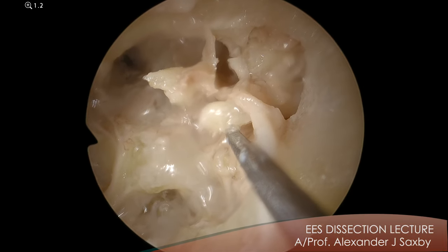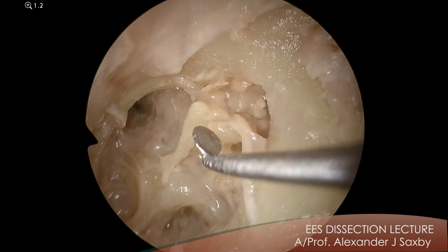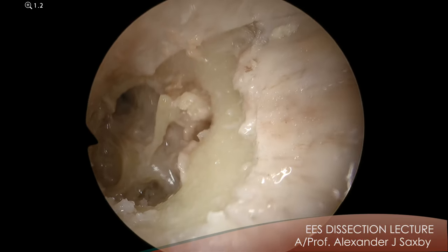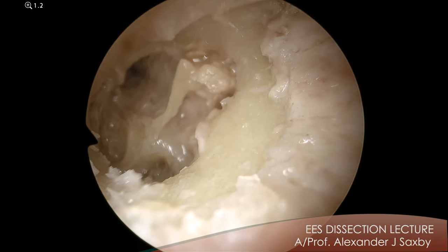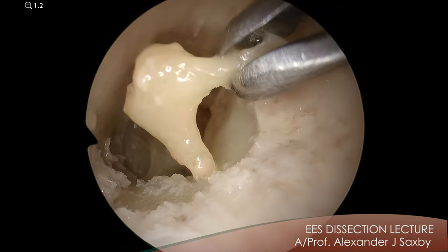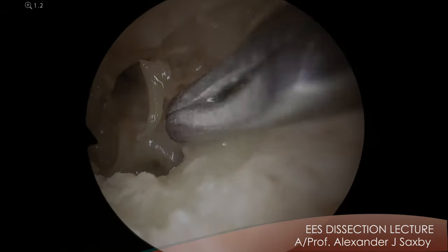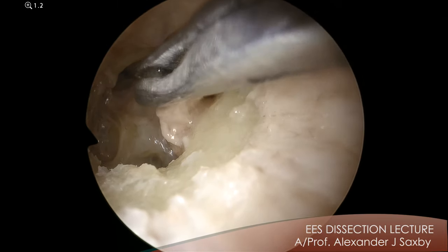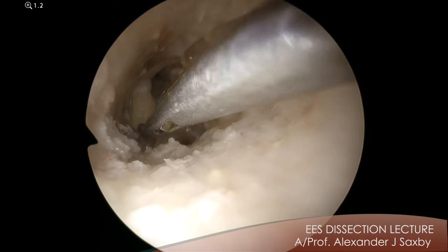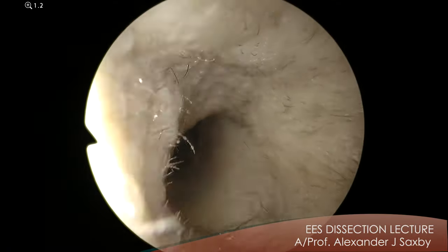Once you've removed that joint then you're safe to actually remove the incus. So let's pull out the incus. I think the chorda we will remove as well. So I'm going to take the chorda away, take the ossicles out and show you the epitympanum. This is the incus — you can see I'm holding the long process, you can see the short process, you can see the body where it articulates with the malleus. And the head of the malleus, which articulates with the body of the incus, and has the superior ligament heading up towards the tegmen.